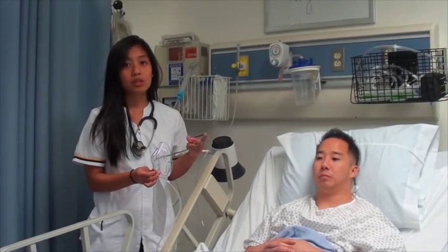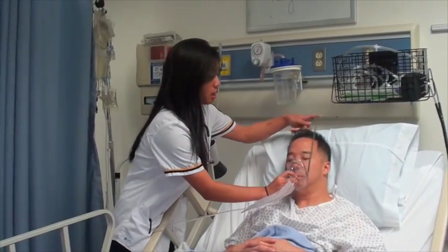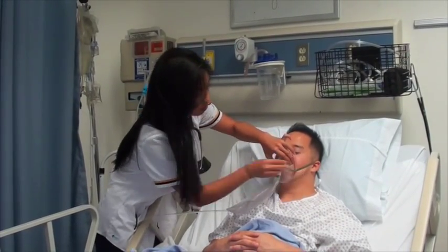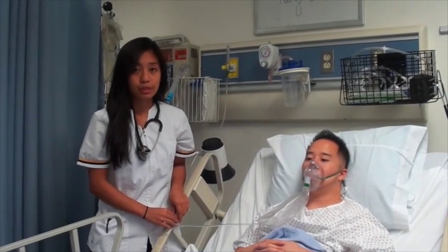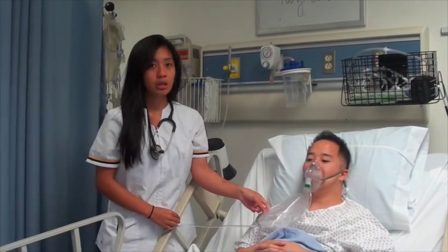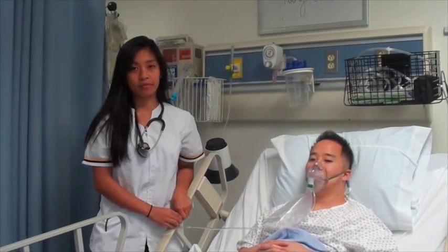When putting the mask on the patient, you want to make sure that the mask fits snugly on the nose and mouth. And you want to monitor the patient closely because intubation may be the next required intervention. If deflation occurs, you can always increase the oxygen flow rate to keep the bag inflated.